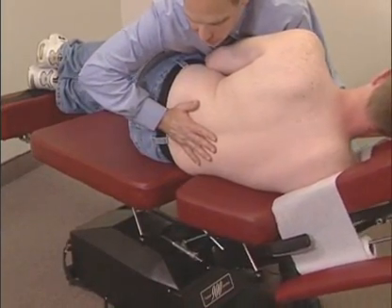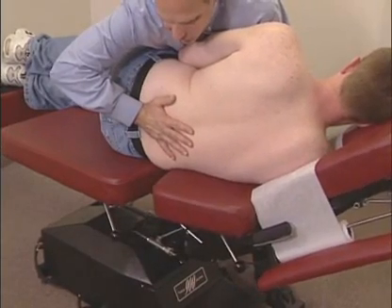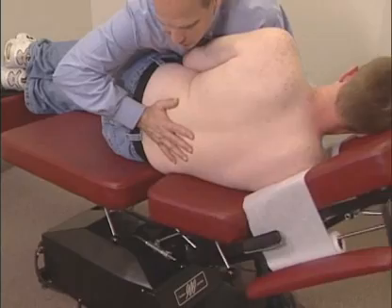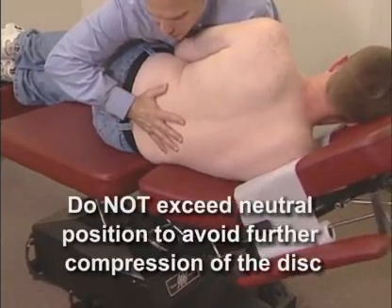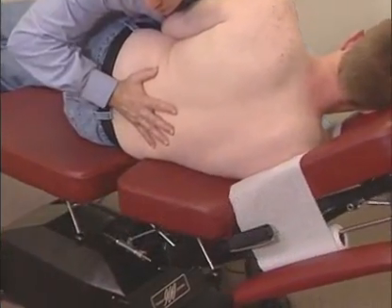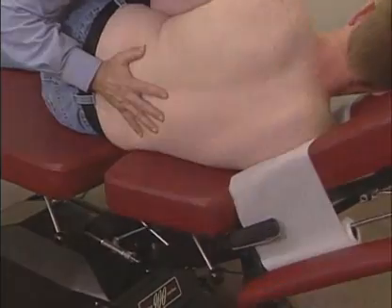With the right hand, use a firm palm contact on the spinous of the L4 vertebra. Slowly flex the table towards you as far as possible and return the table to its neutral position. Do not exceed the neutral position to avoid further compression of the disc. Repeat 10 to 12 times. Stop if the patient feels any discomfort.